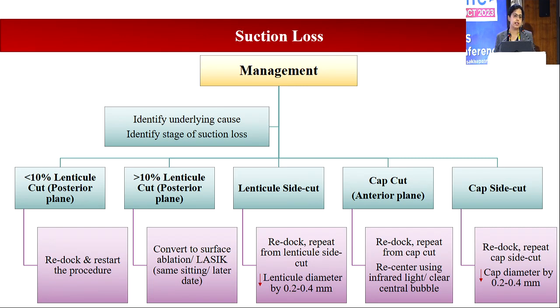So in less than 10% of lenticule cut, you can redock and restart the procedure as if from the beginning, from point 0. Greater than 10% of the lenticule cut is where the challenge lies, because you cannot really restart from the initial point. You cannot restart in a rescue mode. You have to convert it into a surface ablation or LASIK, preferably at a later date. Lenticule side cut, cap side cut, are relatively easier to manage because you can redock and repeat from the point at which the suction loss occurs after adjusting the parameters slightly as provided by various nomograms, and use the infrared light and the clear central bubble to recenter.